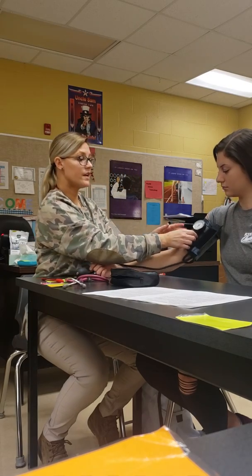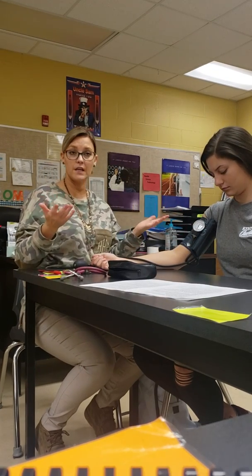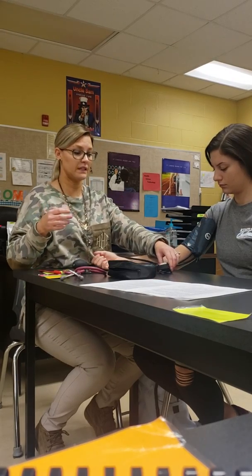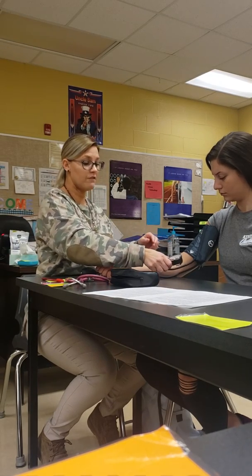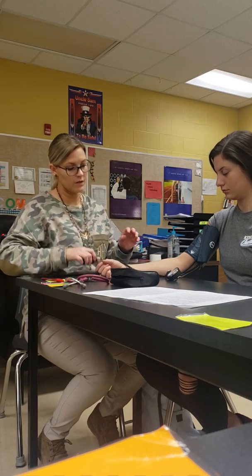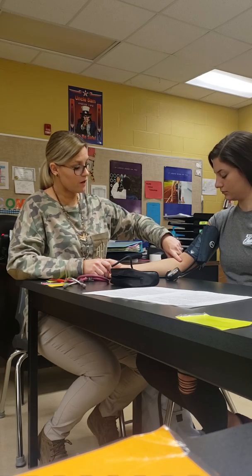If I leave this on here, I would just take this and roll it up on the side of the gauge. I tend to prefer to have the gauge off and on the table, but that's completely up to you guys. If you do take it off and put it on the table, I want it snapped back on before you take the blood pressure cuff off so this doesn't get busted. Okay, I have the blood pressure cuff on. It's at least 1 inch above the bend of her arm.